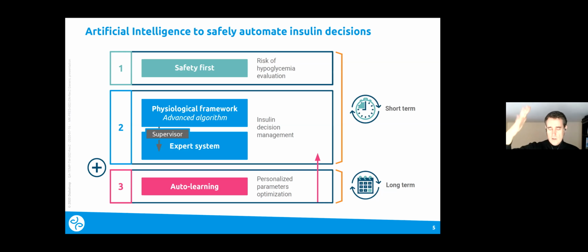It's going to cut insulin preemptively, or if cutting the insulin is not enough, it's going to tell you, hey, you do need to take sugar right now, because if not, 15 or 20 minutes from now, you will be down. And then it's also going to tell you how much: 5 grams, 10 grams, 15 grams. If there's no safety issue, it's going to go back to the heart of the algorithm.